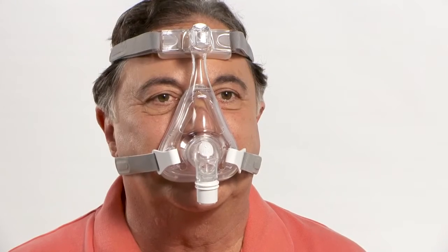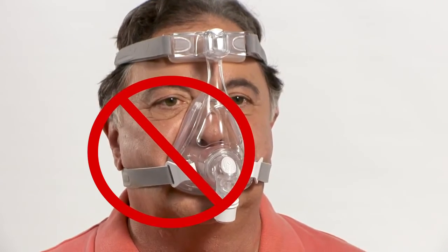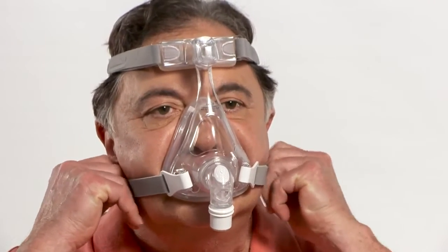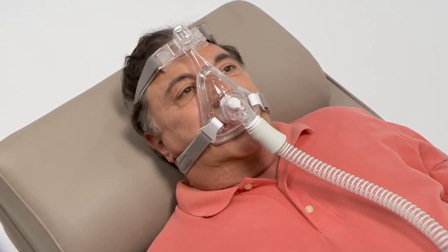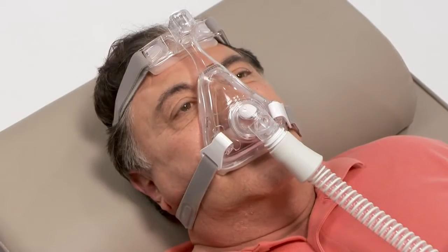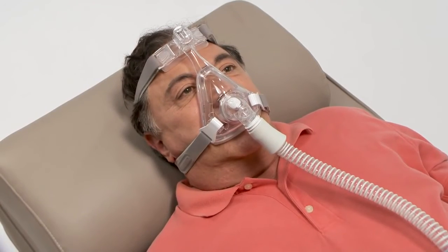The headgear should fit snug but comfortably. If your skin bulges around the mask or you see red marks or impressions on your skin, loosen the headgear straps. The headgear tabs should be closer to the front of your face and not over your ears. Excessive tightening of the headgear may cause unnecessary discomfort and leaks. Remember, not all leaks have to be corrected when using a Philips Respironics therapy device.